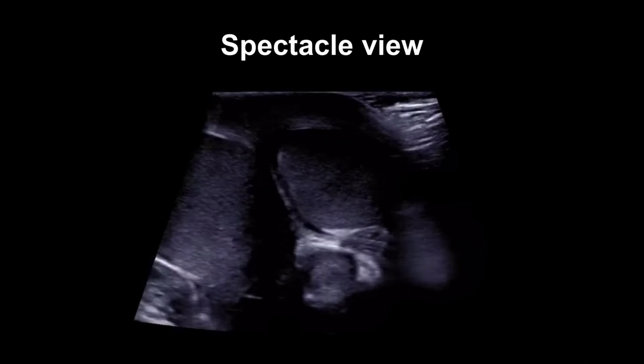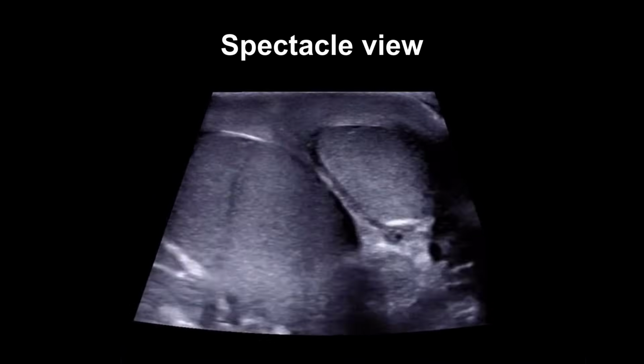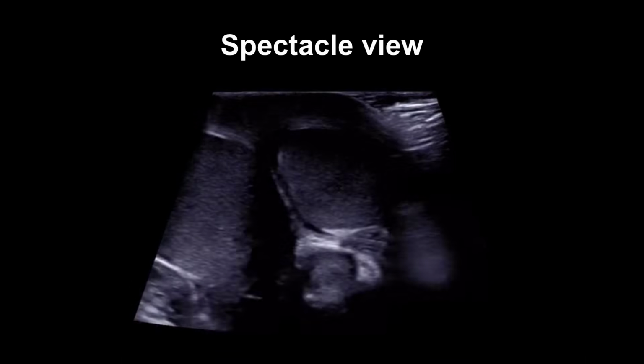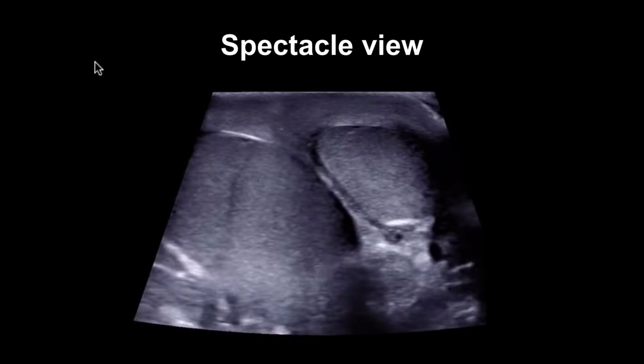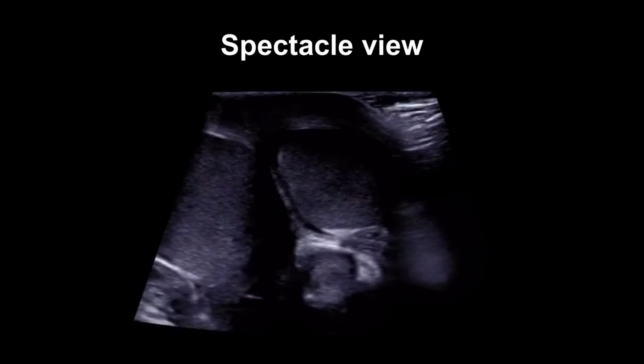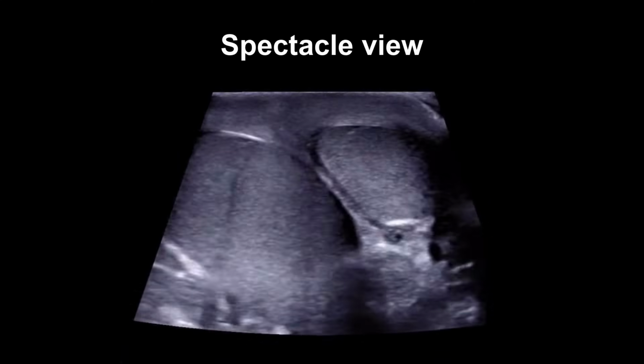In this clip, we see that the testicle at left appears enlarged compared to the one on the right. There's also a small rim of hypoechoic fluid seen here, consistent with edema. This would be suspicious for torsion, and we'd certainly want to proceed to Doppler evaluation next.